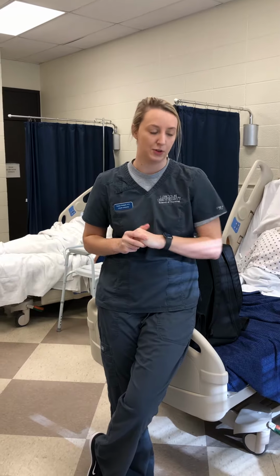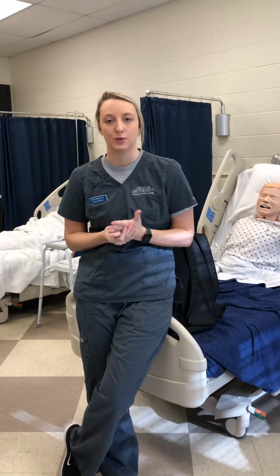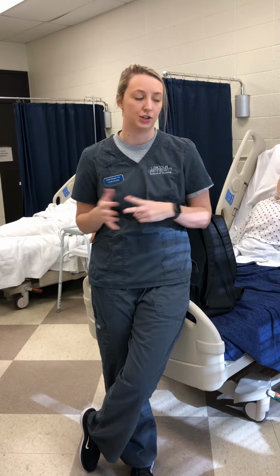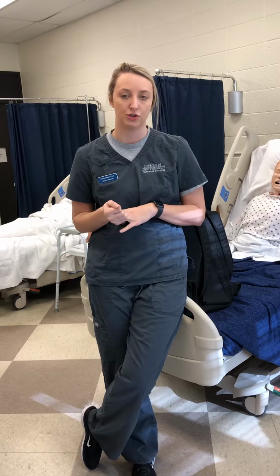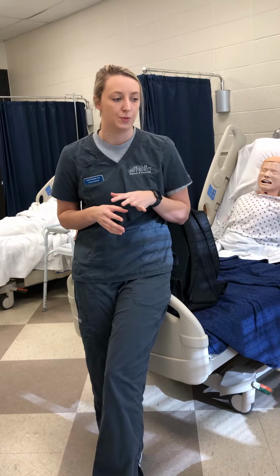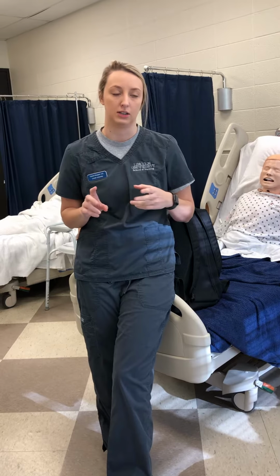I'm a 6th semester. Today is March 5th, it's 9 o'clock, and I'm doing my Foley insertion video. Before entering the room, I would make sure I know why I'm inserting the Foley. I would make sure I have an order. Usually, Foley is inserted for OB patients because of an epidural placement, urinary retention, or they're going to surgery. And then I would make sure I have all my materials ready when I go in the room, and I would also check their allergies before placing it, especially for latex or iodine.